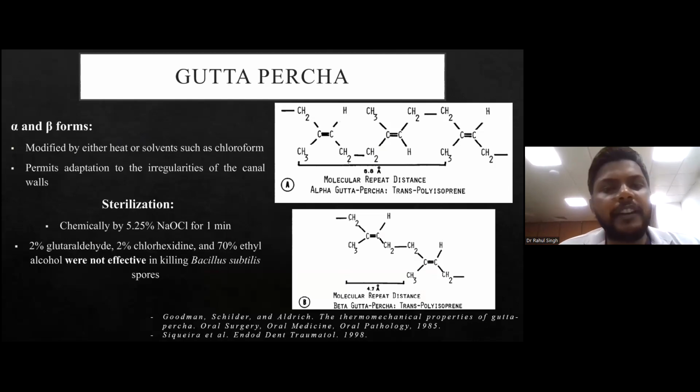I have made a video on my Instagram channel on sterilization only. What I found is that we often don't do it because of the assembly of this gutta percha. Supposedly we segregate the gutta percha on our chair table, but it gets mixed easily, and we forget in which canal which gutta percha is to be used.